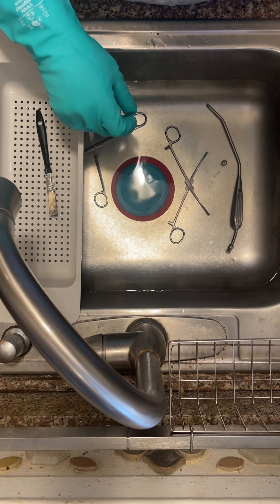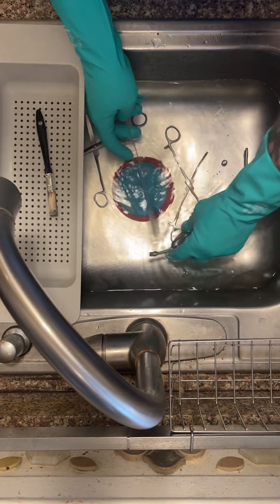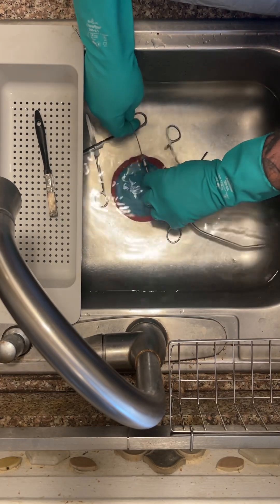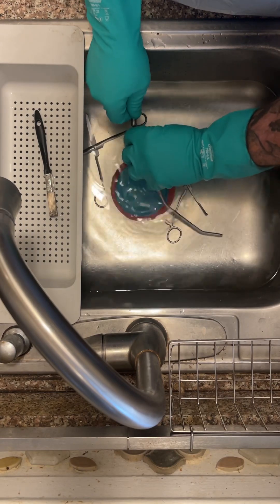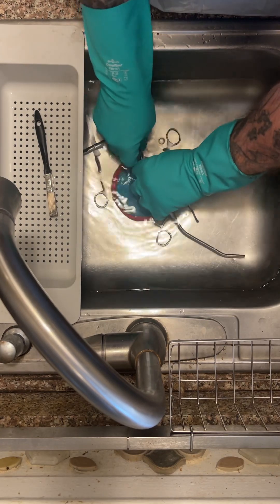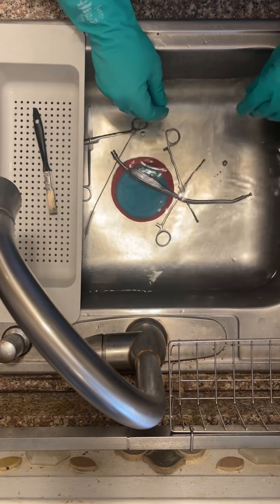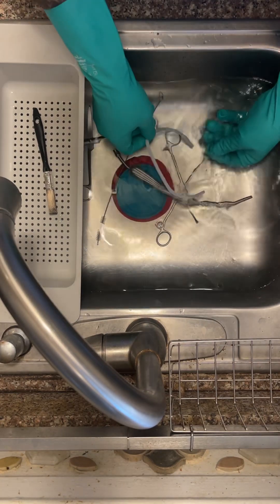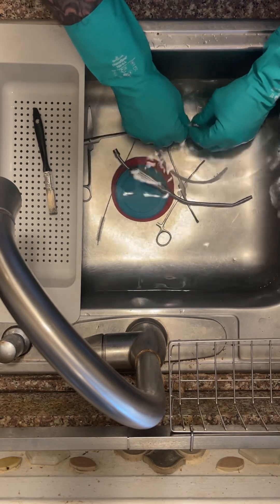With your Yankauer suction device, you're going to use the brush under water, going all the way in and through, making sure to get all the way to the end. Normally you would push in one way and pull out the other end, but this particular brush doesn't allow for that. Make sure to get all of the little tips and pieces cleaned while it's under water.